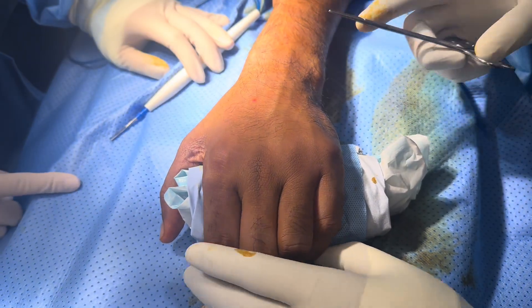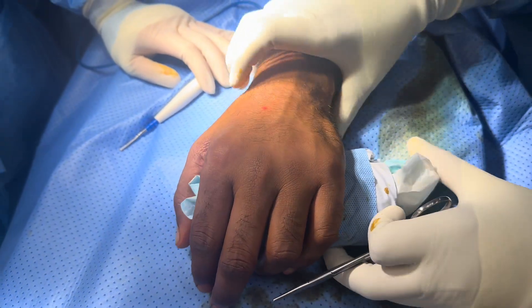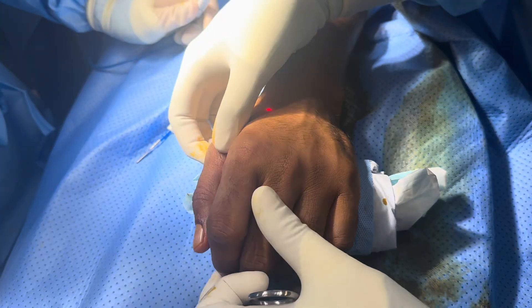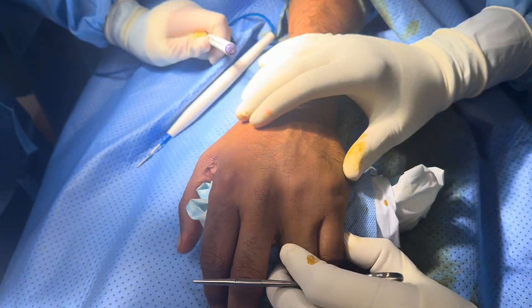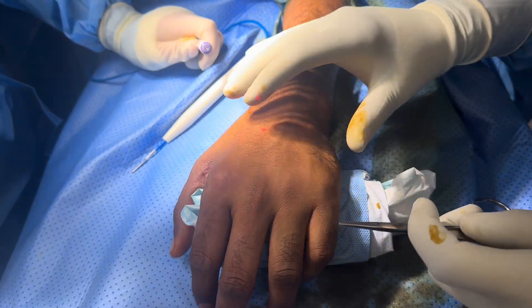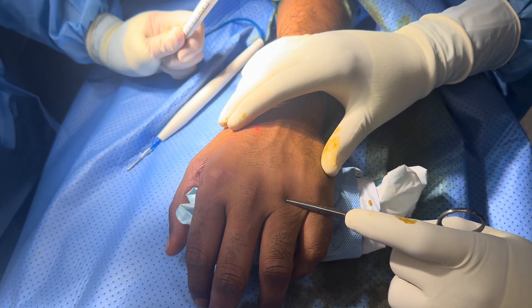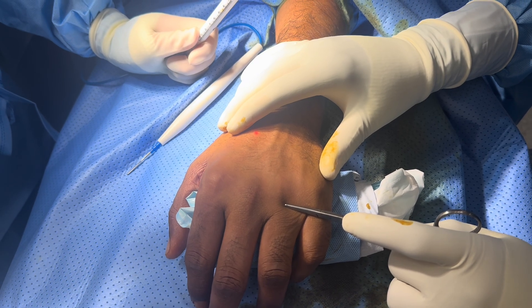So now we will do the marking. Before the surgery, we have to mark the length of the bone. We are going to keep the finger in the flexion position to make the metacarpal accessible, so that the fracture will be well exposed. I will do the marking under the C-arm. That will help in planning the skin incision so that we do not need to extend the incision further.